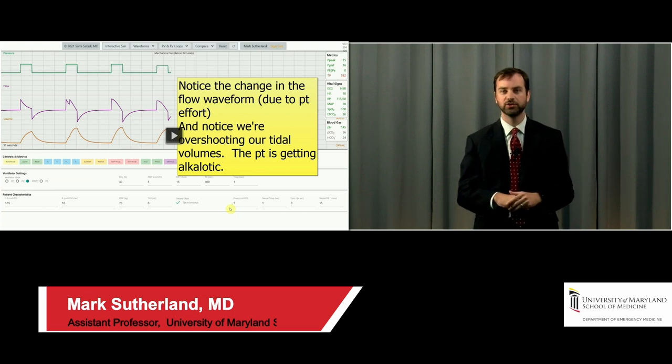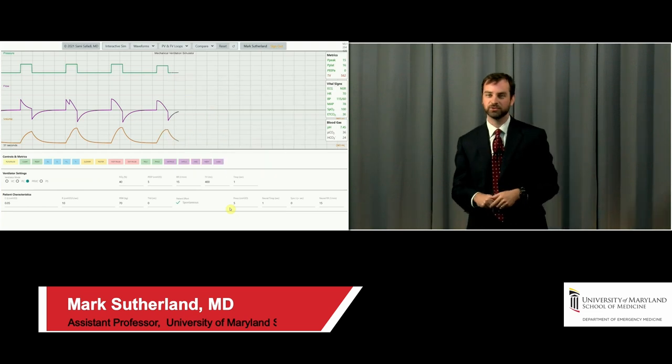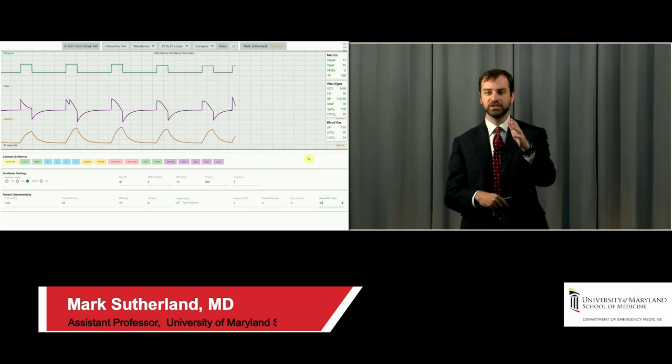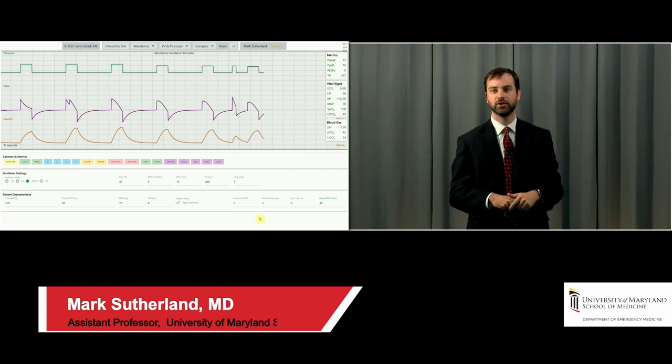In a second, the video is going to start again. You can ignore the pause. I forgot to take that icon off the screen there. The video will start itself. And I don't know if you can see, what I'm doing now is increasing their respiratory rate to 30.